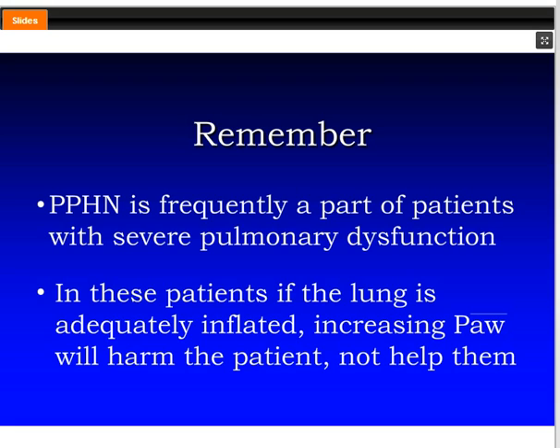Well, I think that's always a good question. My answer is that if you have patients who are in a state of somewhat overinflation because of air trapping, then you are better off suctioning by pausing the ventilator.